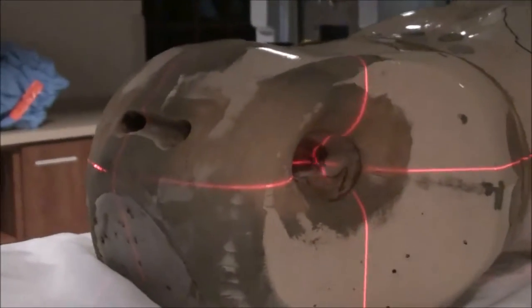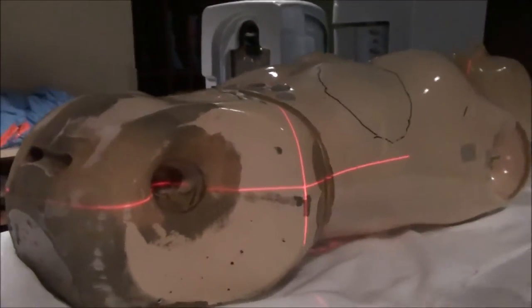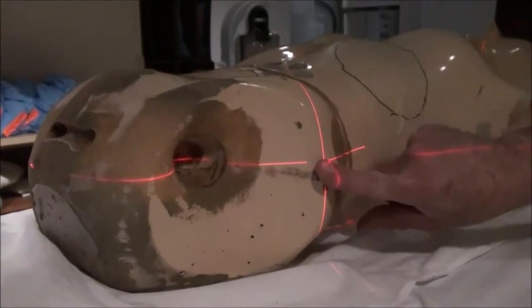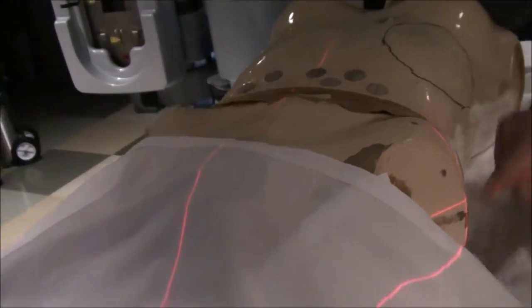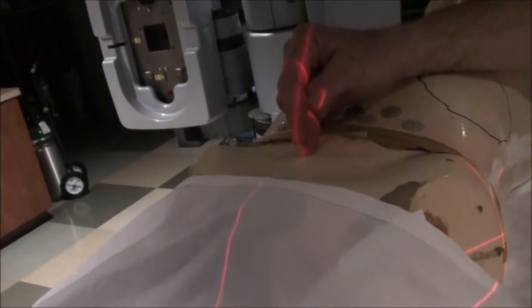We're going to use the tip of the hip to make it easier to see. Either way works — wherever you palpate, just go up, down, in, and out to that. For left and right, you're going to basically center on the pelvis. If you have the sheet down far enough that you can see where the base of the penis starts, just center on that. It's pretty easy to get in the middle of the pelvis as a ballpark. So: greater trochanter, then left and right to the midline. Now we're going to go to fluoro.